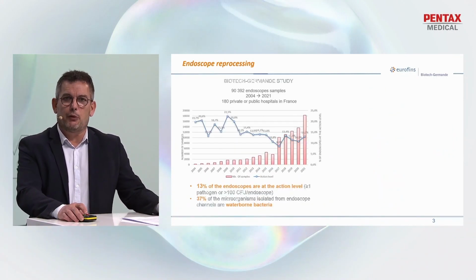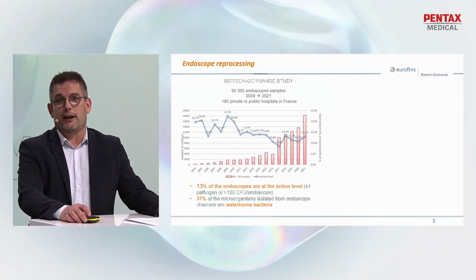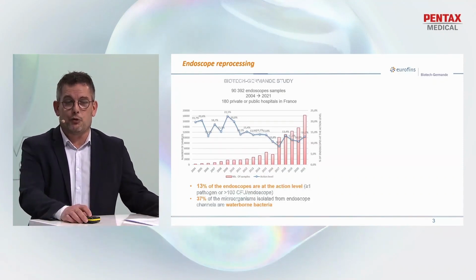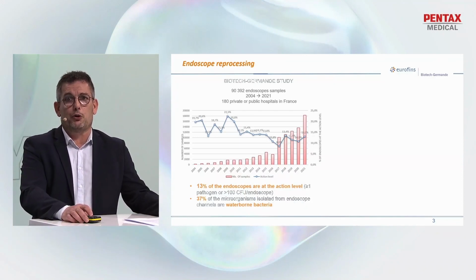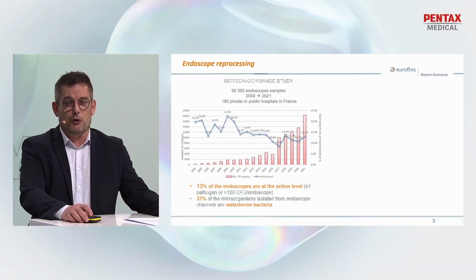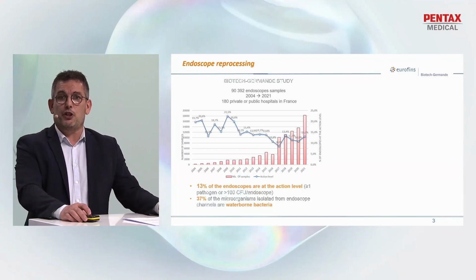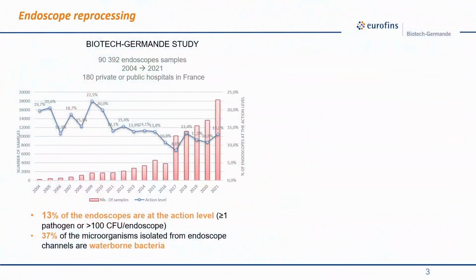But before starting, I would like to share with you some important information regarding the quality of the endoscope. As you know, we have only few data regarding this quality and the percentage of endoscope contaminated after reprocessing. And we don't know if we are really doing a good job when we reprocess them. The follow-up study performed in our laboratory since 2004 will give us some information about the quality of endoscope, at least in France. We have performed a lot of sampling, close to 100,000, which is a huge number.